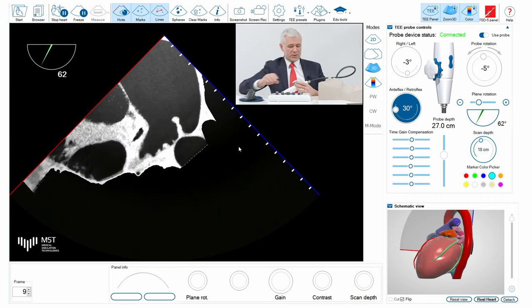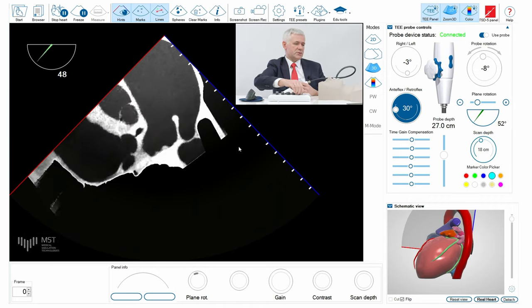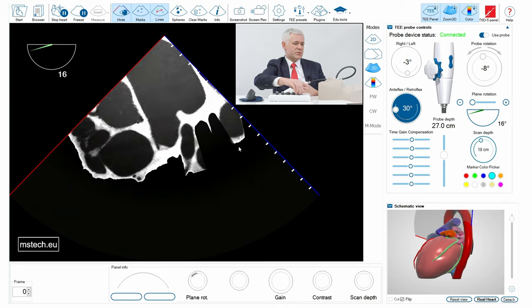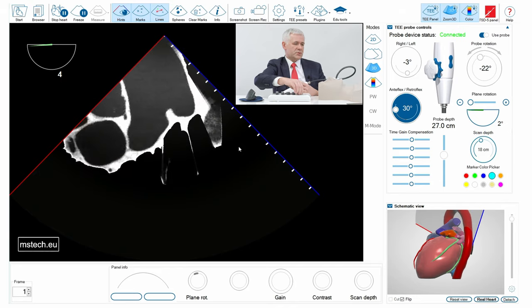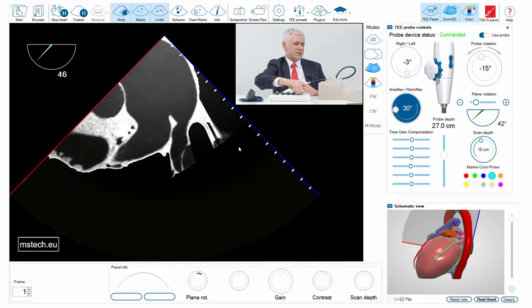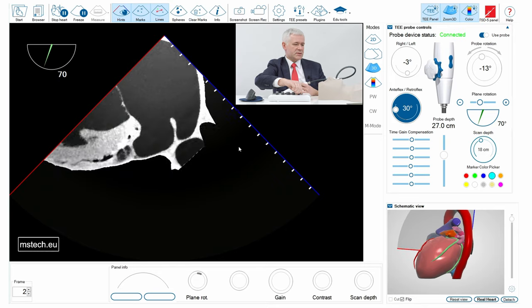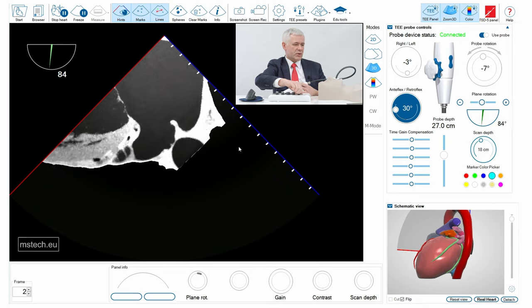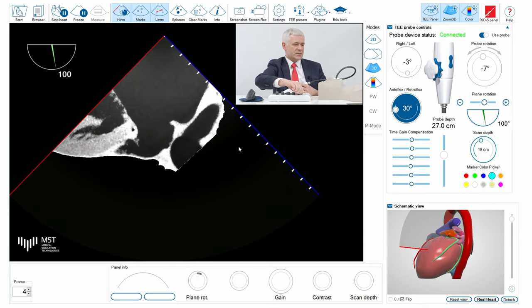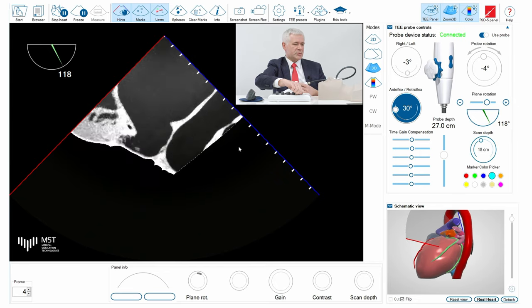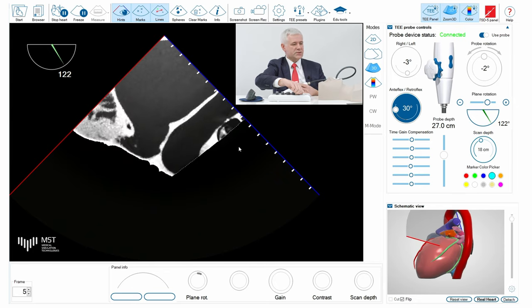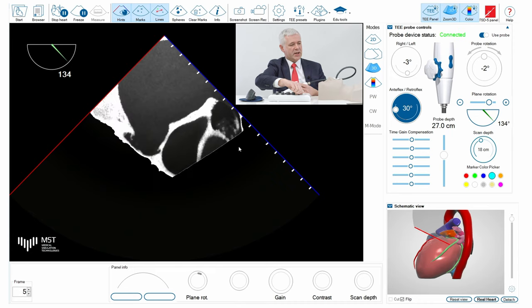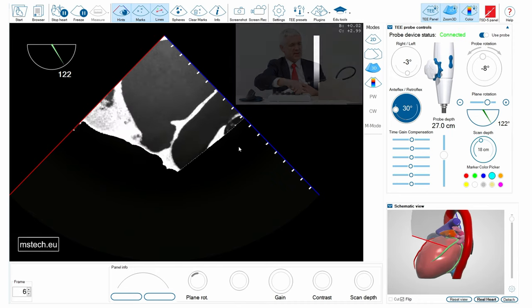And then once you rotate the plane from 0 to 135 degrees, you will see this appendage all the time in your scanning plane and you can appreciate the complete complex structure of this appendage and measure properly the orifice.